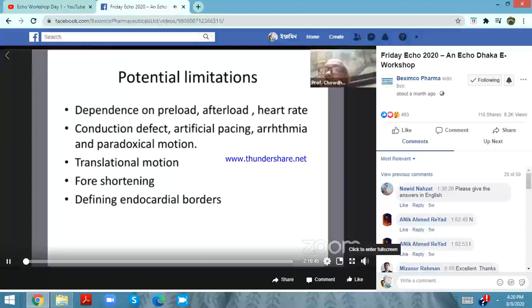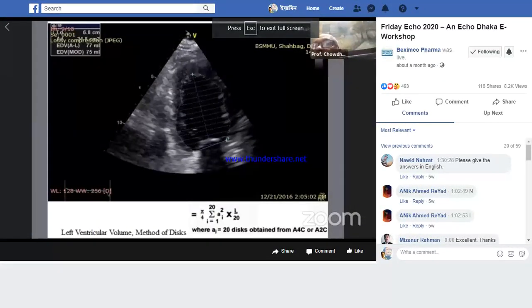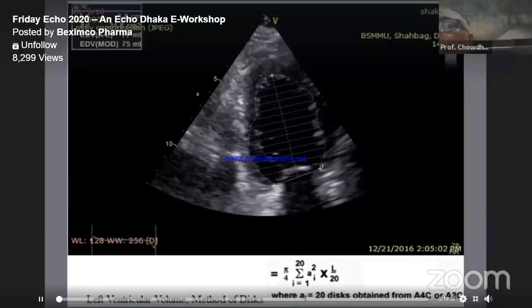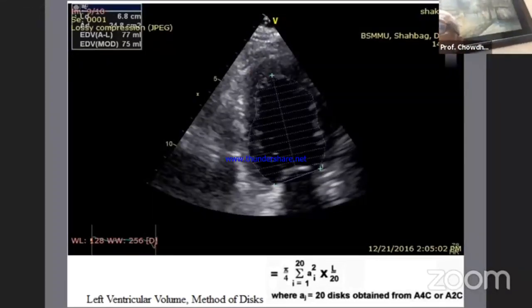Echocardiography. So when we are asked to do the quantitative assessment of left ventricular systolic function, the first test all over the world is now the modified Simpson method of assessment of left ventricular systolic function. Although in our day-to-day practice, we are still practicing the Teichholz method.